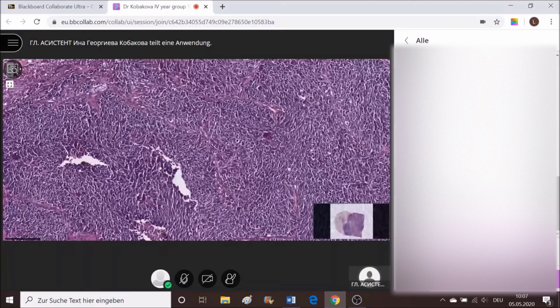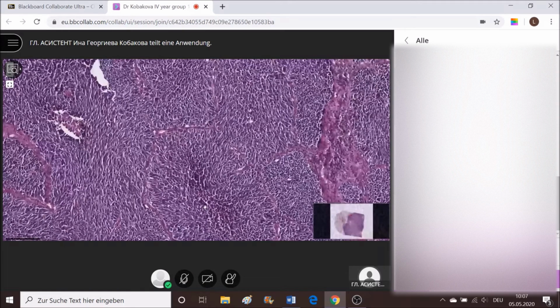And if we enlarge these cells, we can observe that there is a specific manner of arrangement of chromatin inside the nuclei. It's in the form of salt and pepper clusters, which is due to the chromatin arrangement here.